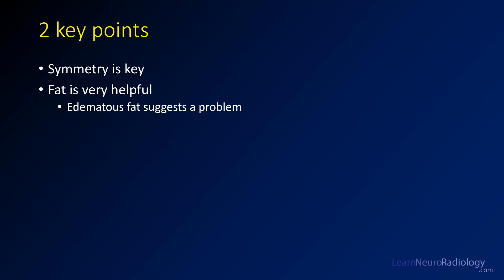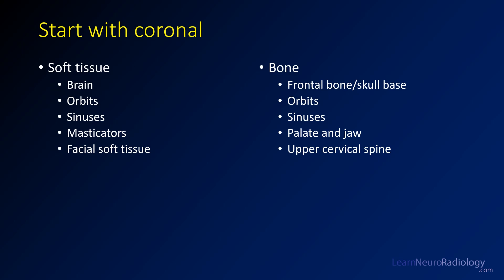Two key points: symmetry from left to right is really helpful — that's why coronal and axial are more useful than sagittal. Fat is also super helpful; if you see nice clean fat, you probably don't have too much of a problem. Start with the coronal and begin with the soft tissues, working your way down: brain, orbits, sinuses, masticator space, parapharyngeal space, and facial soft tissues. Then repeat that with bone, going through the orbits, sinuses, palate, jaw, and upper cervical spine in the same order.